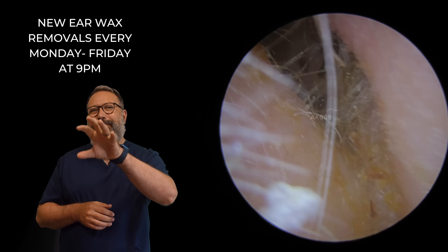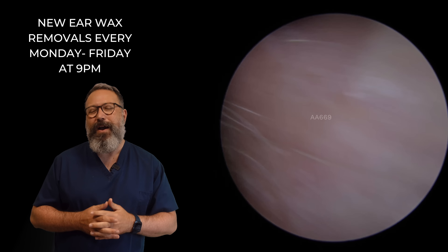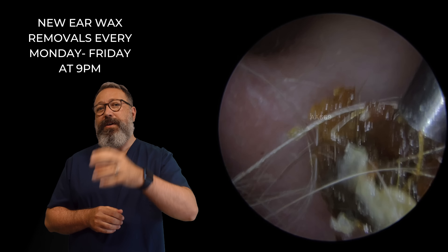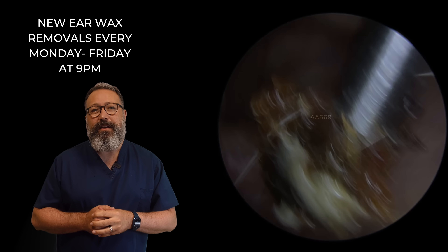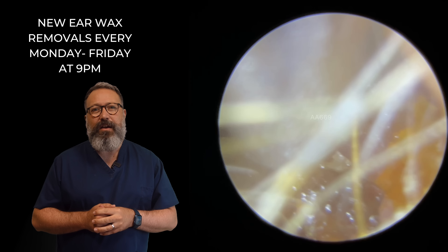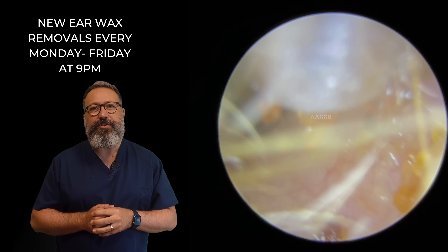Now I can see a couple of little bits of debris left in this — we're going to have to go back in and tidy those up in a second. A little bit of dry skin, that creamy coloured material underneath there as well. So let's get rid of that. And if we take a look behind, there we go — a couple of little pieces to pick up in the suction.